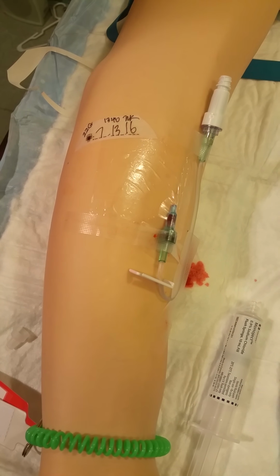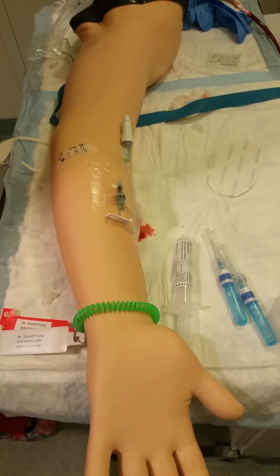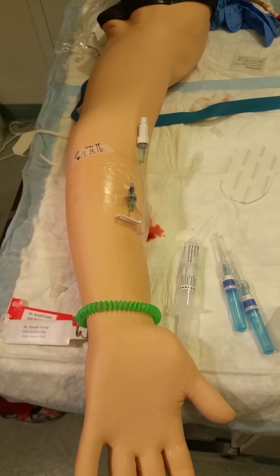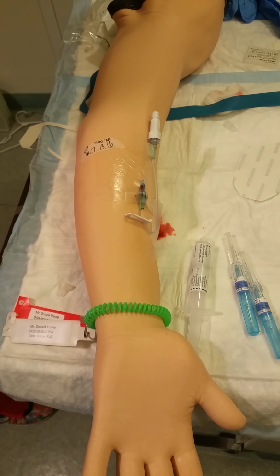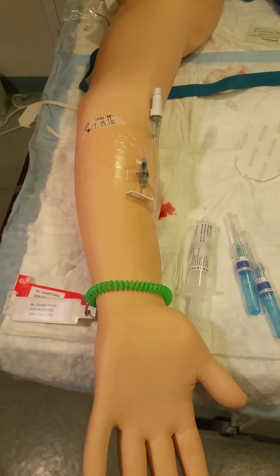And the IV is initiated. We have a peripheral IV with a saline lock in place. The location is the left anterior forearm, 22 gauge catheter. I was successful on my first attempt starting this peripheral IV for our celebrity patient, Donald Trump.